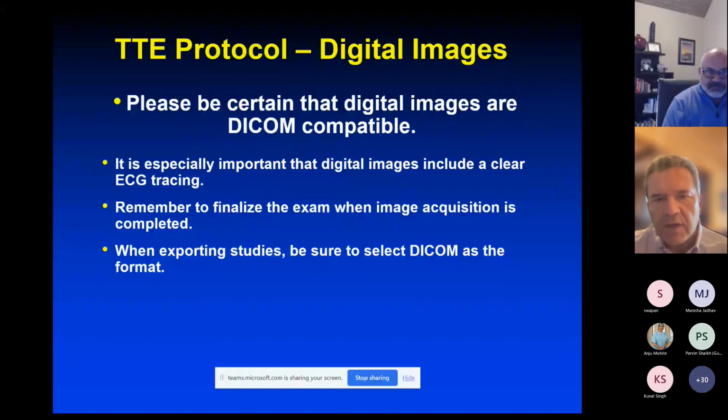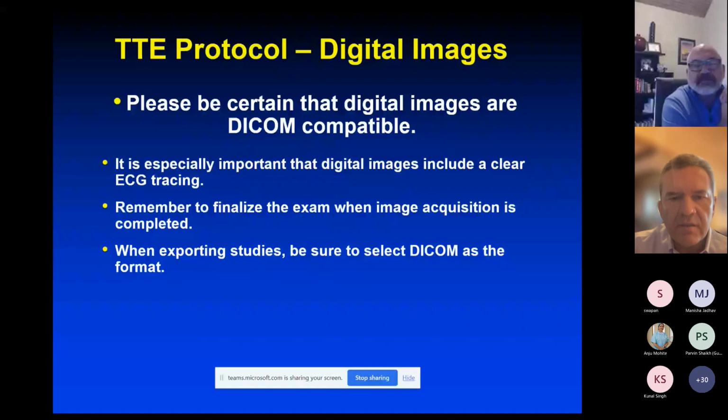And when you save the images, please make sure that they are DICOM compatible. That way we can pull them up in echo reading programs and other image viewing programs. And like we mentioned, it's very important that the images contain a very good ECG tracing of appropriate size. And then, of course, remember to finalize the exam when the study is completed. And then when you save it to export, please select DICOM as the image format.